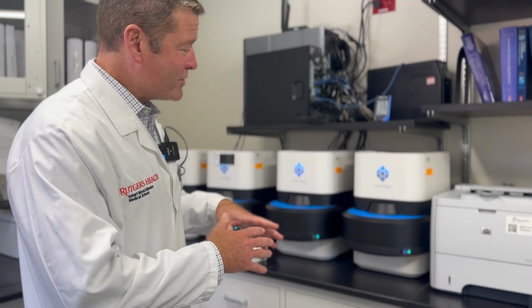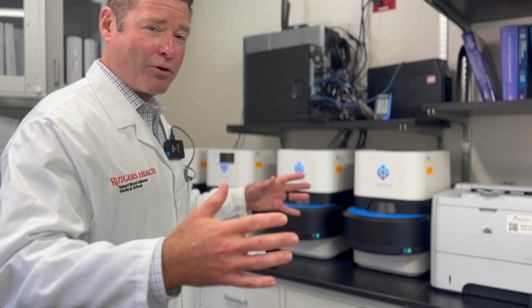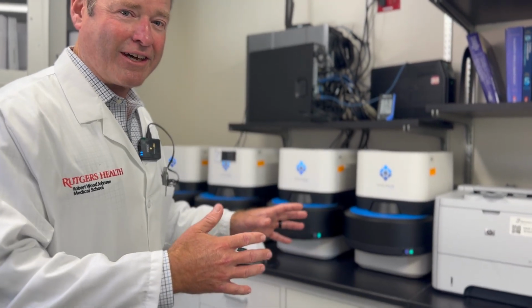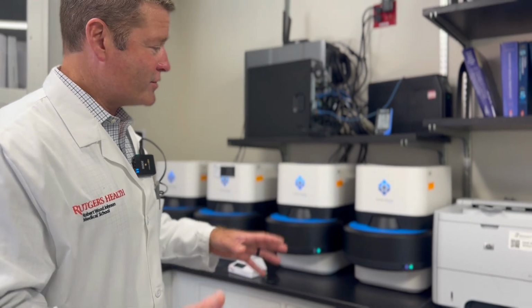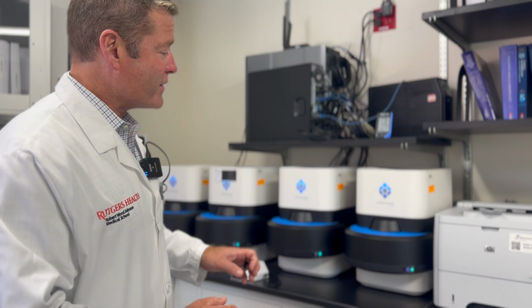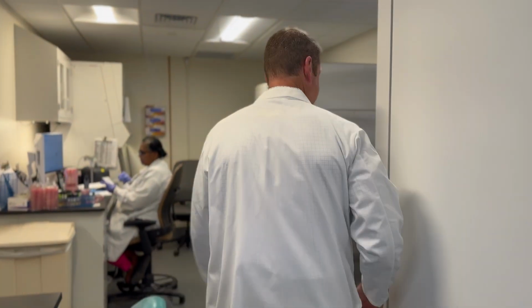And what happens to the bugs, depending on whether they're susceptible or resistant to the antibiotics, is their growth and morphology are different. And so this can detect differences in morphology as a function of time and predict susceptibility to certain antibiotic combinations. And we use these for gram-negative rods predominantly. All right, so if that's not fast enough, we have something even faster. Come on, let's look over here.